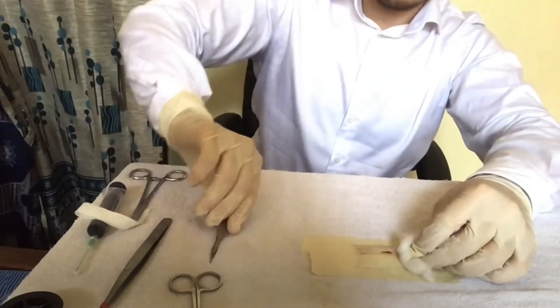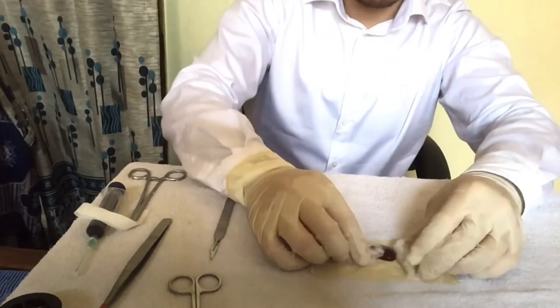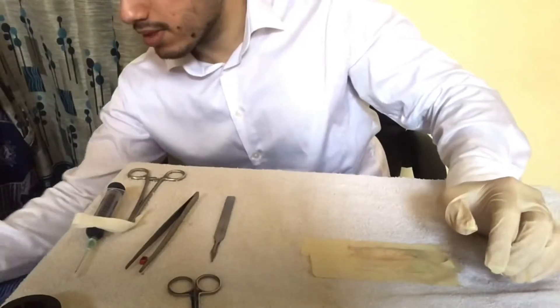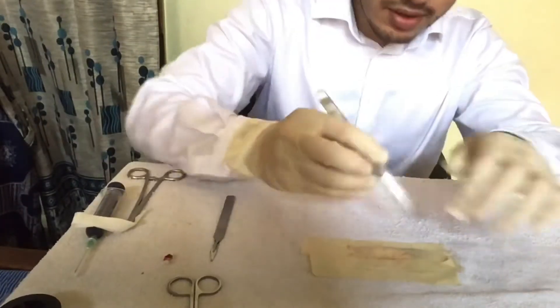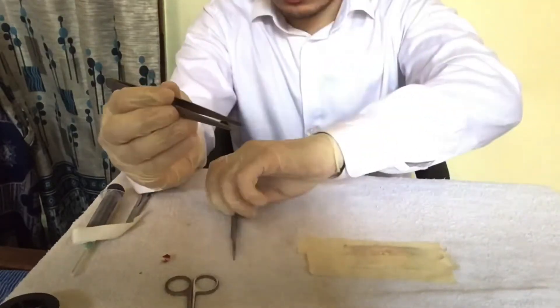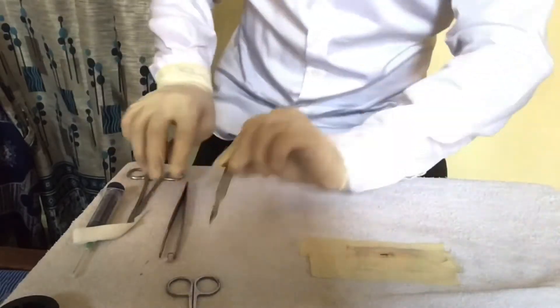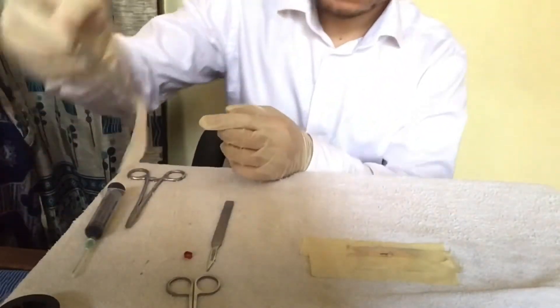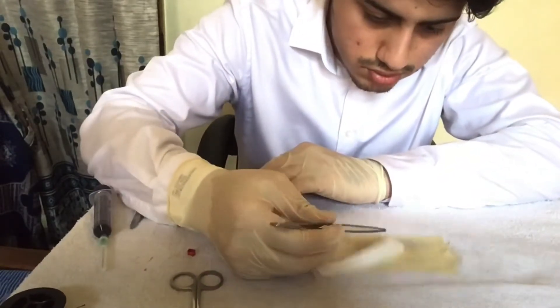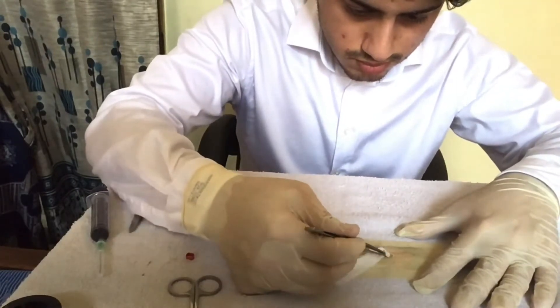From the abscess site, you can make a further incision to increase the flow of drainage. Now make sure the abscess is almost drained with the help of forceps. Then put the wick into the cut so that it will help keep the incision site open and aid in drainage of leftover abscess.